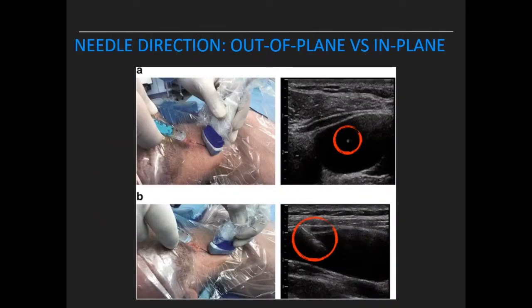In the out-of-plane technique, the needle is seen as a tip in the vessel known as a target sign. In the in-plane technique, the reverberation artifacts of the needle are seen throughout the procedure entering into the vessel.